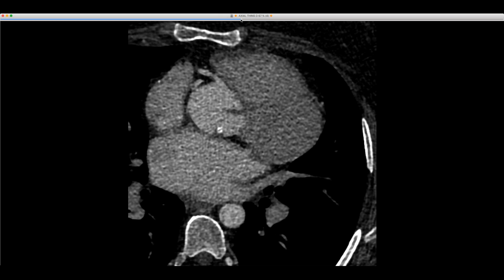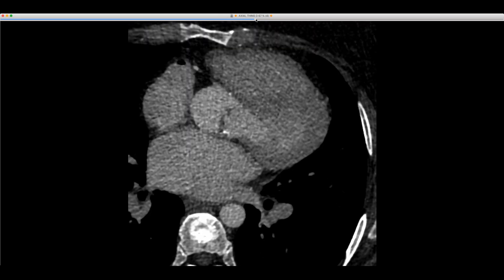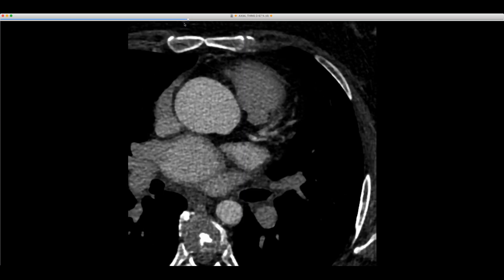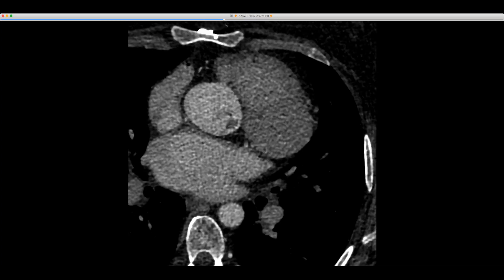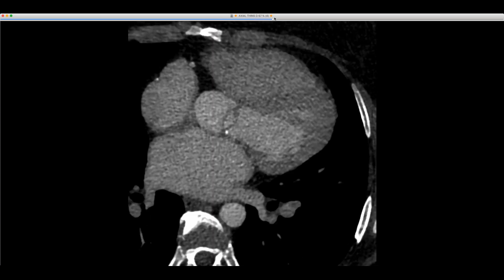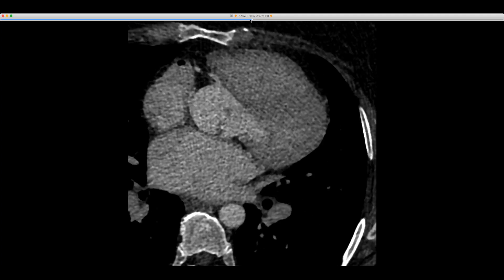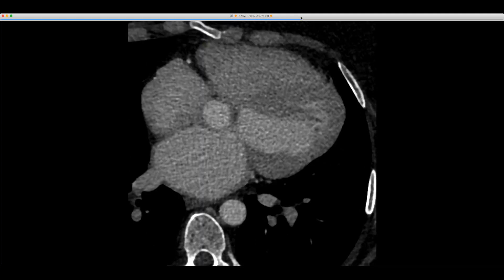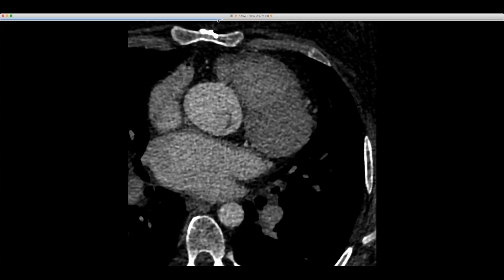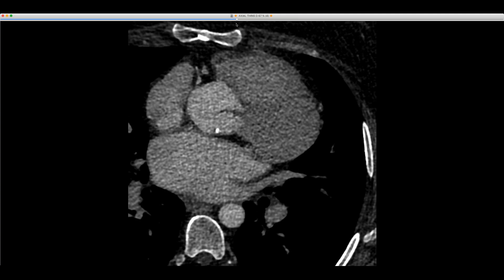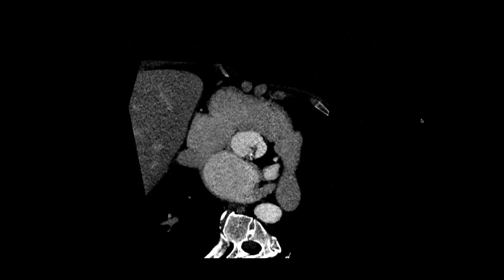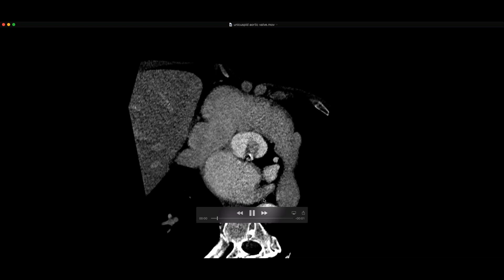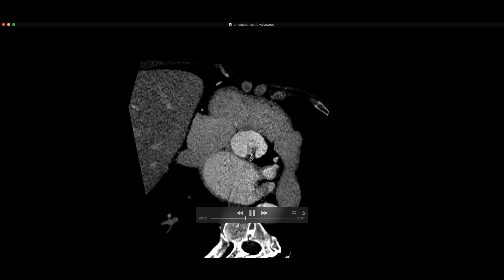This is a 42-year-old man who obviously has an ascending aortic aneurysm. Coming down, you can see there's an abnormal aortic valve — the aortic valve is thickened and has some calcification. It doesn't quite have the appearance of a congenital bicuspid valve. Let me show you the reformats. This is a unicuspid aortic valve — specifically the unicommissural form with a single commissure. The valve is obviously thickened and calcified. These tend to develop aortic stenosis relatively early.